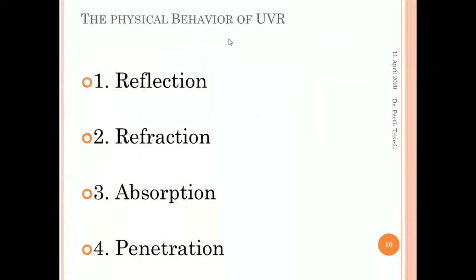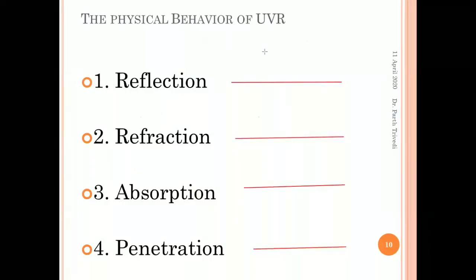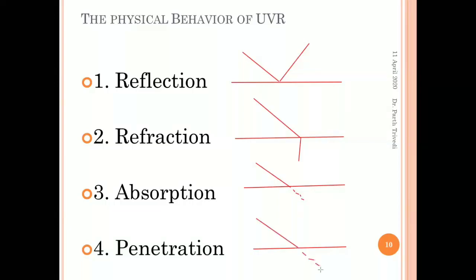So it has common phenomena. It works on reflection, refraction, absorption, and penetration. When the incident ray falls, this is your reflection, this is your refraction, and this is your absorption into the surface and penetration till the depth of the treating surface.